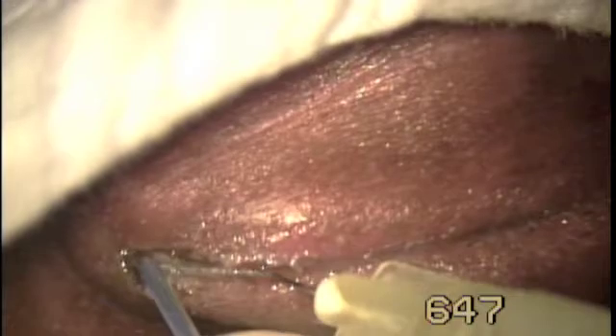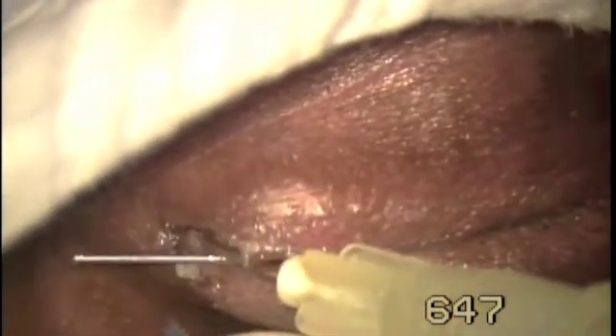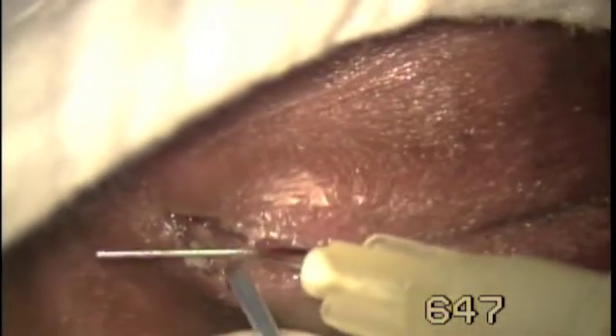Quite an easy procedure. Just lift the cannula and keep cutting. There is no danger to the cornea or sclera.